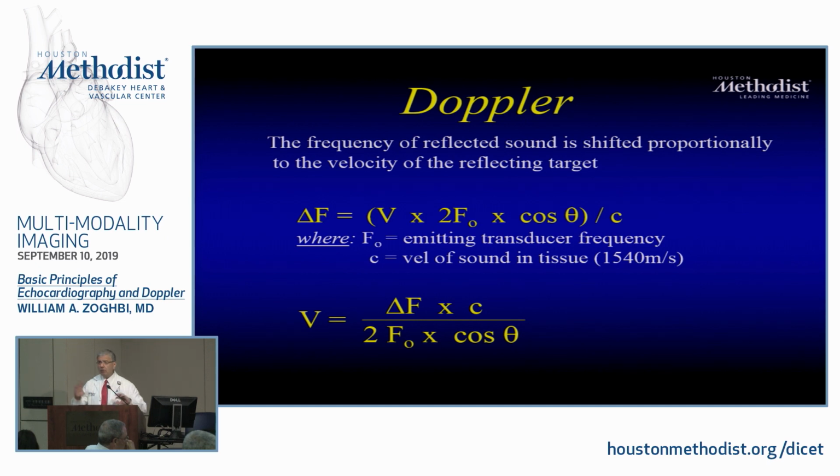So all the ultrasound that you use nowadays, you look at the scale, it is solving the equation. Okay, so it's putting V as the delta F, et cetera. In the past, to tell you the truth, the x-axis or the y-axis was frequency. Okay, so we assume that cosine theta is negligible if it is less than 20 degrees or so. Okay, and the example of cosine theta being 90 degrees, cosine of 90 degrees is what, 0, okay?